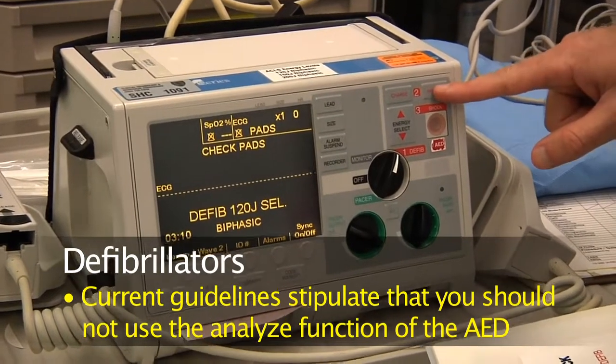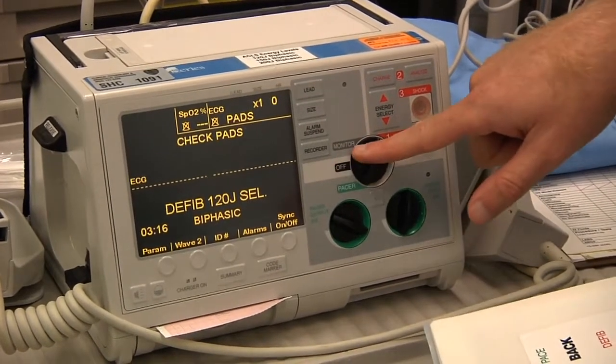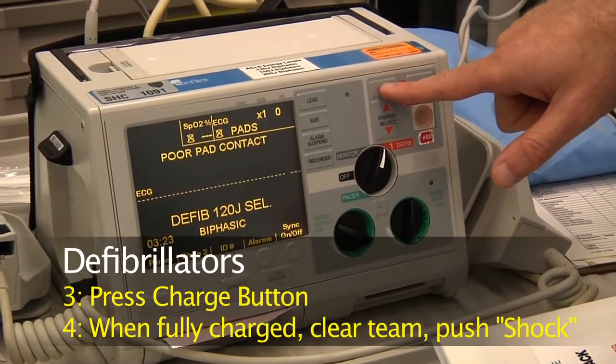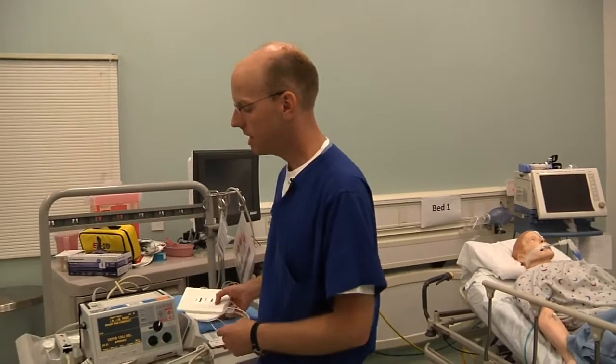Using the analyze button takes time, breaks in CPR, which are detrimental to the patient. So reviewing, you turn it to defib, you select your energy, you charge. Once it's fully charged, then you clear the team, you defibrillate, and have the people go immediately back to the compressions. Now, that's the defibrillator.